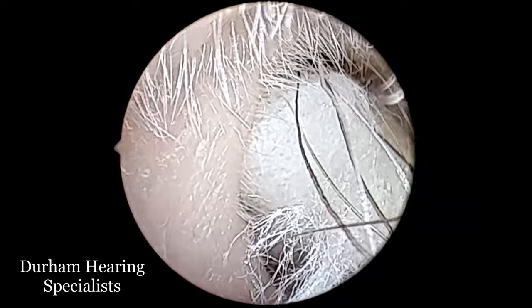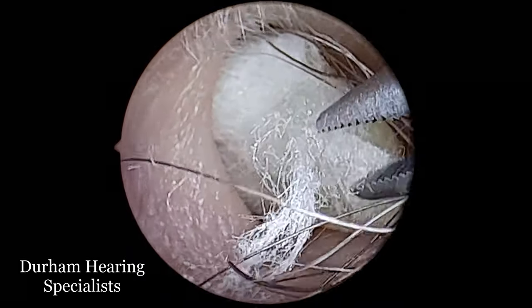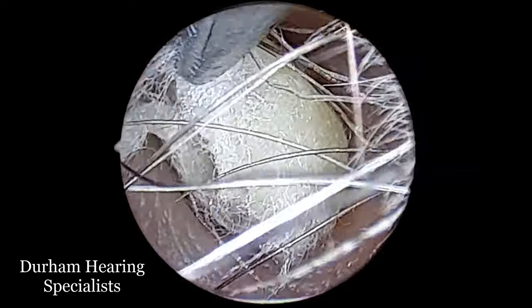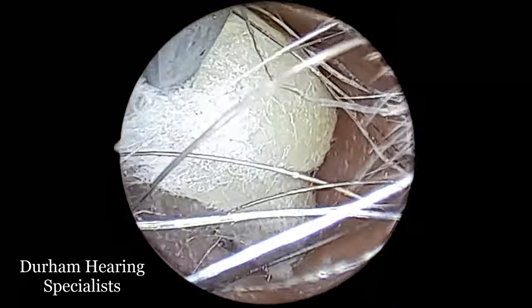Now there's nothing sinister going on, but what has happened is that this cotton wool mass has pushed the wax a little further into the ear and also acted as a very effective tamponade or sponge essentially, soaking up all of the olive oil that the patient had previously applied.